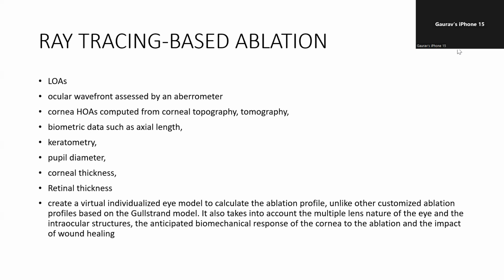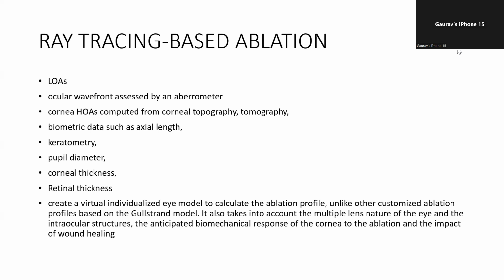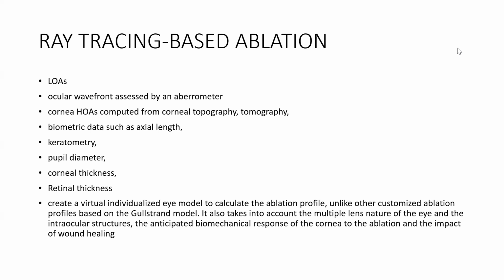On which machine? Sir, there only in the LASIK center. So what is that machine? Sir, I'm just not getting the name. I know the name, sir. The topolyzer. Doppler. Right.